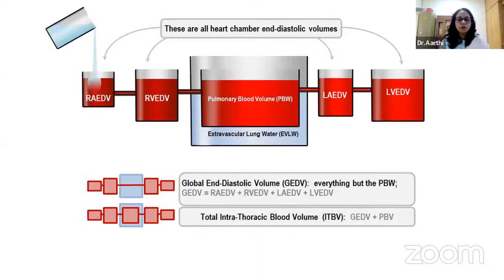So just an overview of what we phrase as the thermodilution technique, or indicator dilution technique: an indicator or cold saline is injected into a central venous access and then measured at the distal end, either at the proximal arterial access or a radial access. So the thermal volumes are calculated using various formulas. So these are all the different thermal volumes. This is how the temperature distributes into different chambers of the heart, which provides different information about the thermal volumes in the intrathoracic system.